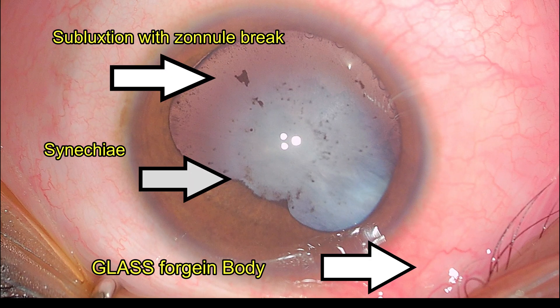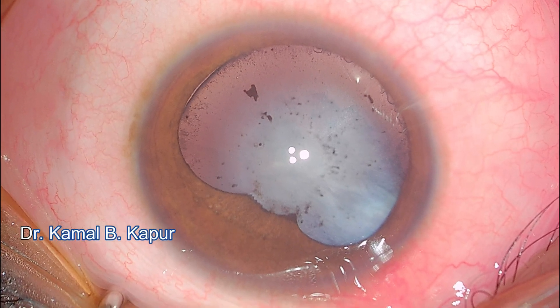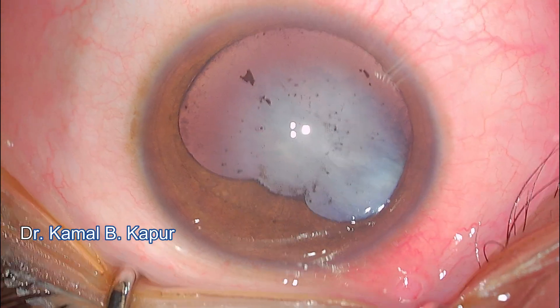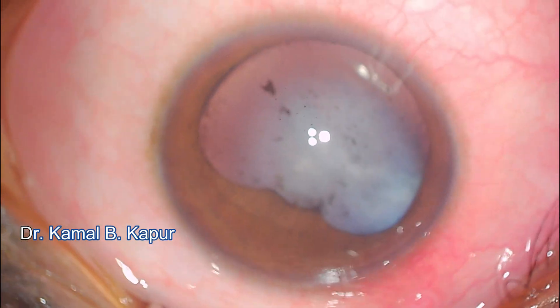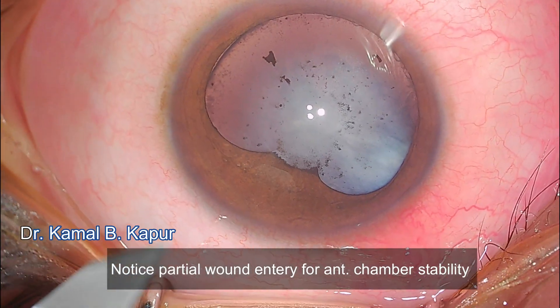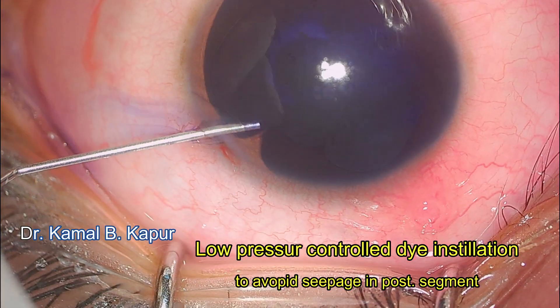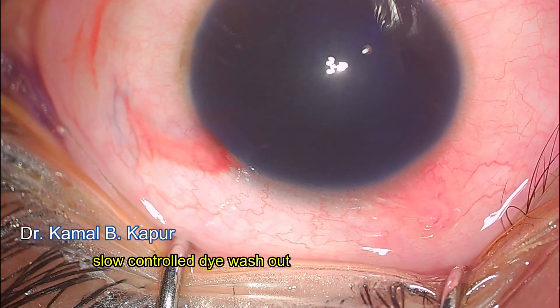In this case, the patient had a blunt trauma with broken spectacles. Glass foreign body particles were removed at the time of injury and he was sent home. He came back two months later with a subluxation in the inferior nasal part of the cataract, posterior synechiae, and a shiny impacted glass particle on the superior nasal side which will be removed once surgery is done.